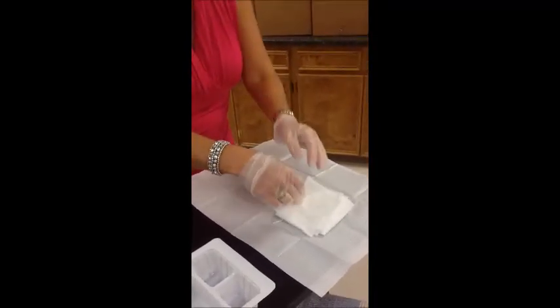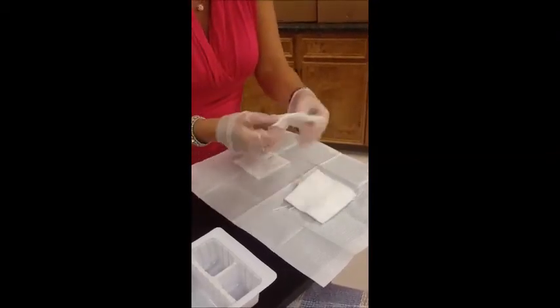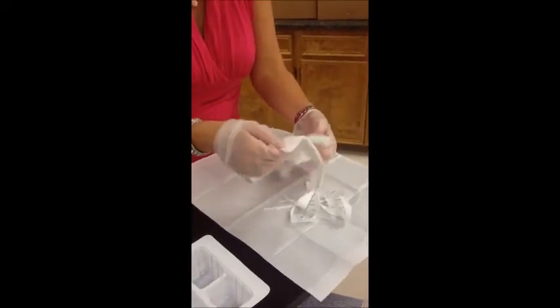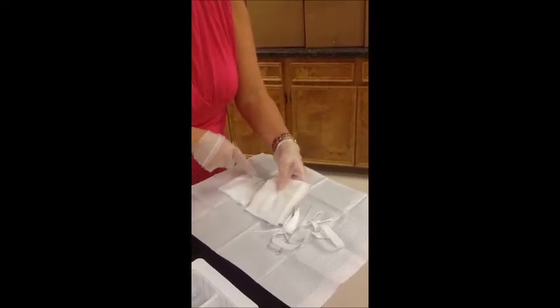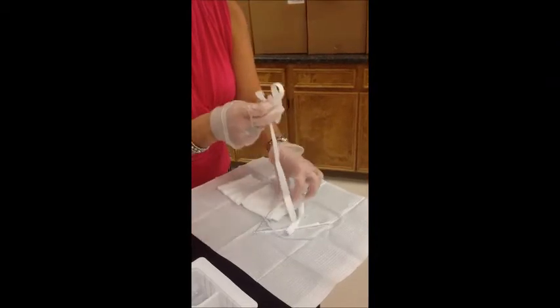Then I'm going to lay my equipment out so I can see what I've got. I've got a split 4x4 and I've got intact 4x4s. Anytime you're doing trach stuff, don't cut your own 4x4. Because when we cut, we make little fibers, and this is pre-cut by the manufacturer, and that's the one you need to use. These are my replacement ties.